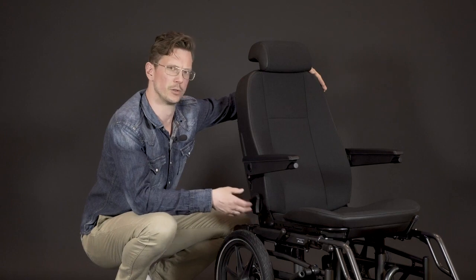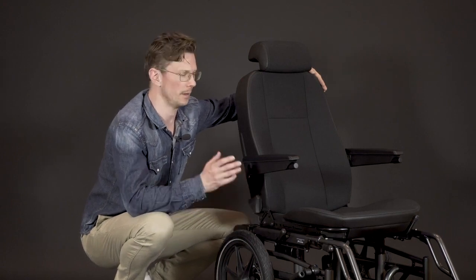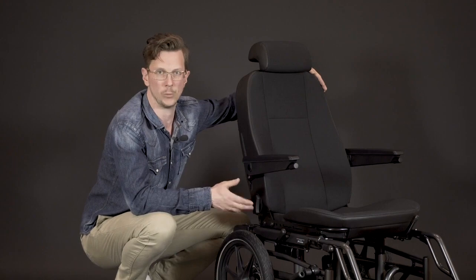By combining all these features with our seating accessories, the Koroni becomes a very comfortable car seat and wheelchair.